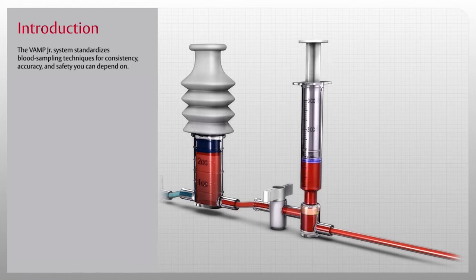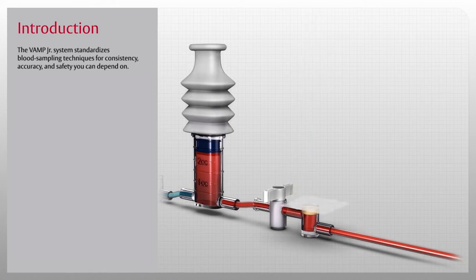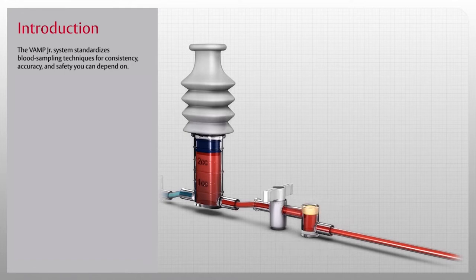The Vamp Junior Reservoir, with a 3cc capacity, reduces patient blood loss and optimizes clearing volumes while providing safer infusion and undiluted accurate blood samples.